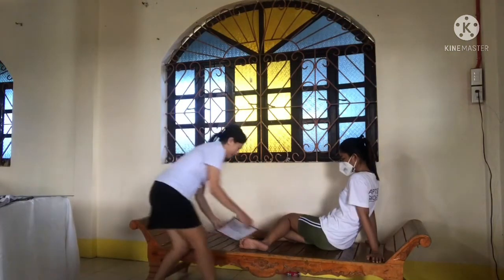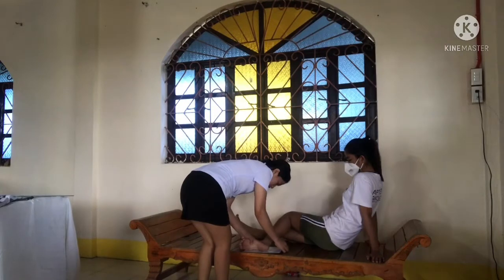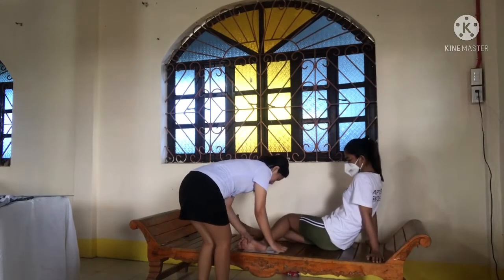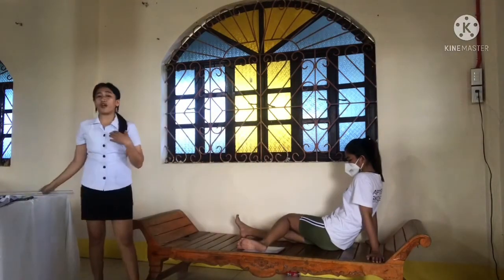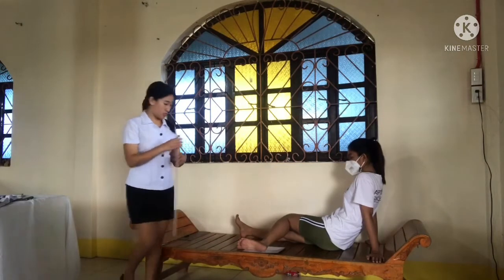So with the medial border of the foot resting on the IR, place a 45-degree foam wedge under the elevated leg. So since we do not have a foam wedge, let's imagine that we put some foam wedge. So the central ray for this projection is perpendicular to a point 1 inch distal and 1 inch anterior to the lateral malleolus.